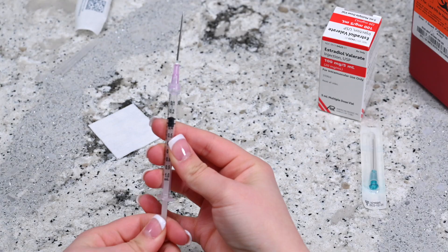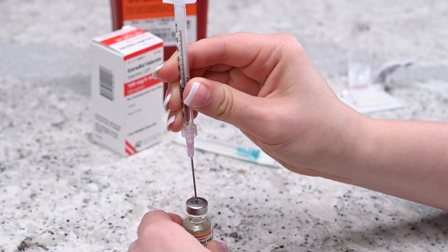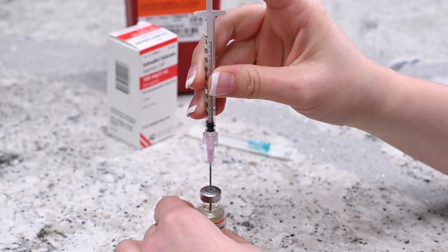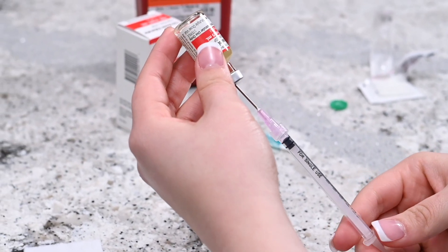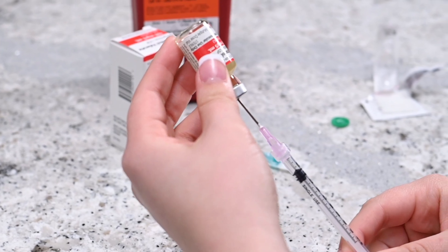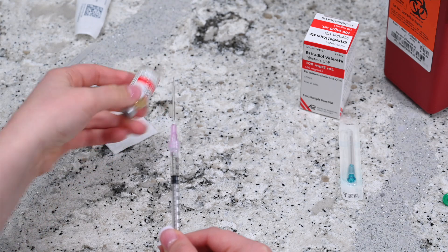Place the needle into the rubber stopper on the vial and press down on the plunger until all of the air transfers into the vial. Invert the syringe so that the vial is upside down but still attached to the syringe. Pull the plunger until the correct dosage of medicine enters the syringe, then take the needle out of the vial and replace the cap.